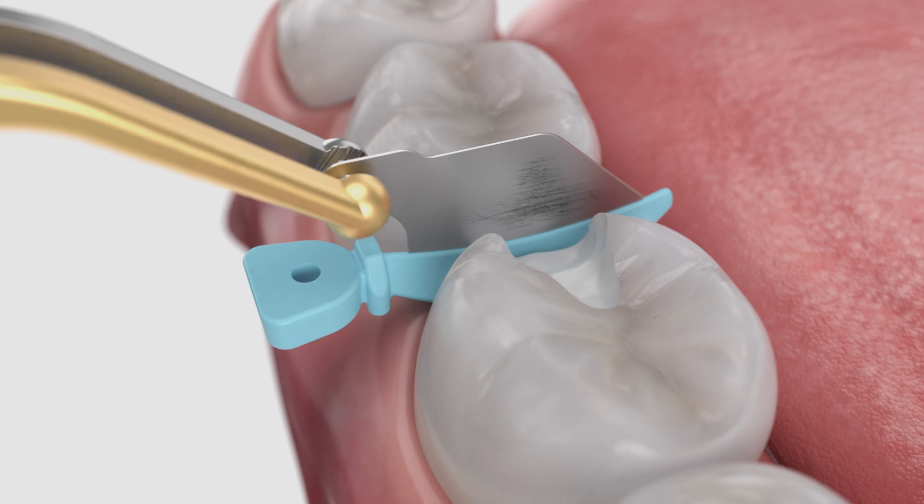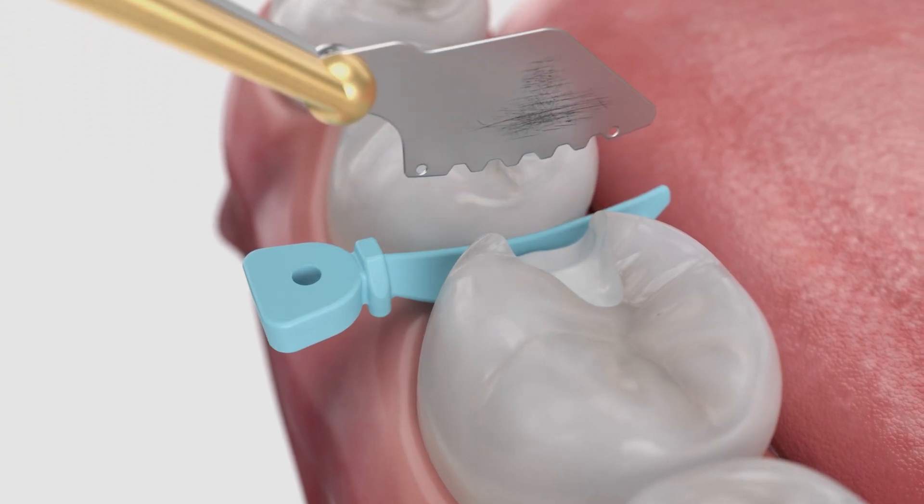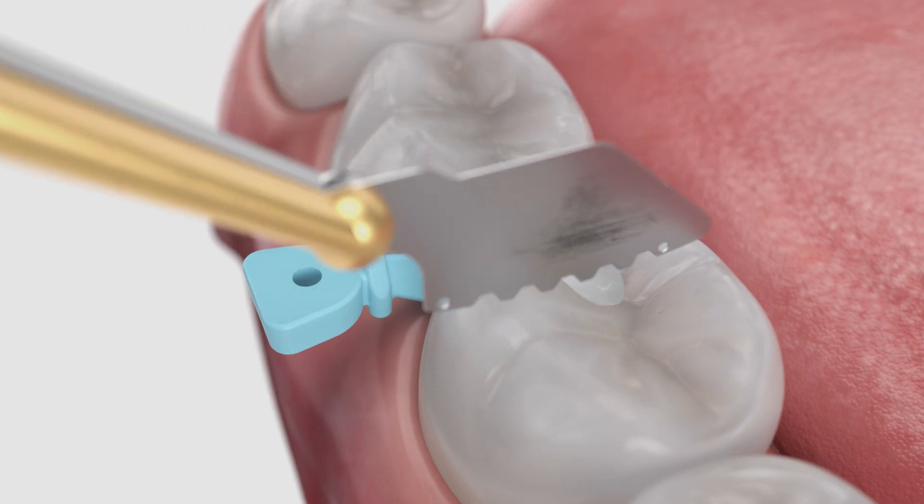Once the preparation is complete, remove the metal shield of the wedge guard. Use the pin tweezers to grasp the hole on the shield and slide laterally to remove.